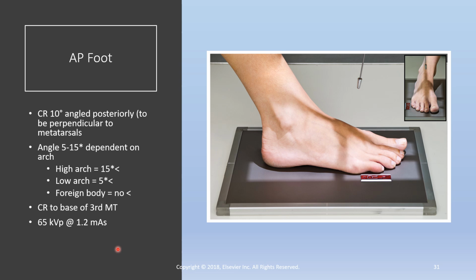Okay. Now, we had talked about the longitudinal arch and the fact that we have to evaluate the foot from the medial aspect to look at the arch. The reason for that is because your central ray angle is totally dependent on the longitudinal arch. So if the patient has a low arch, like if they're flat foot or pretty much flat foot, then you have a 5-degree or less angle on your central ray.